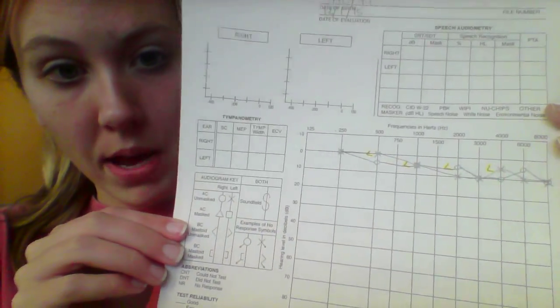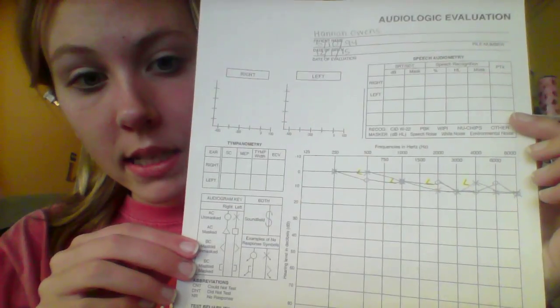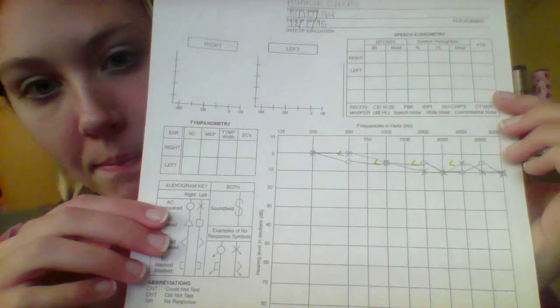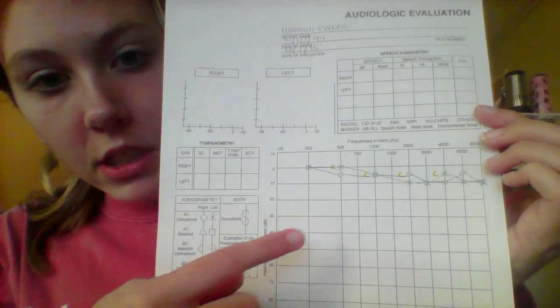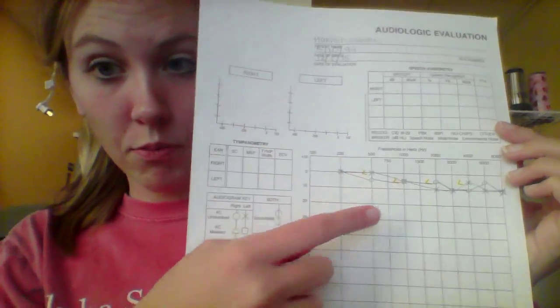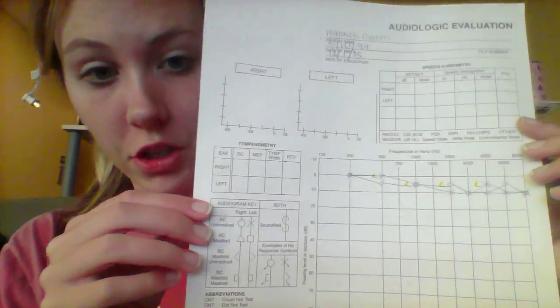And so that's a little bit of a different way that we can test hearing, but it can help us test just the inner ear independently, and that can help us determine what type of hearing loss someone might have. And so, as you can see, her bone conduction thresholds are also all at normal levels, and so this means that her inner ear is functioning properly.